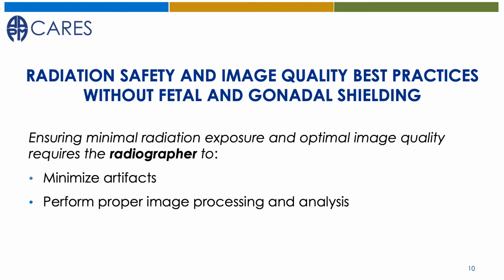As mentioned in the previous slide, appropriate MAS can only be evaluated by correlation with deviation or exposure indices following image processing. Use of MAS that is too low will result in reduced image quality. Use of MAS that is unnecessarily high will result in excess radiation exposure to the patient. It is very important for radiographers to be constantly monitoring for dose creep.